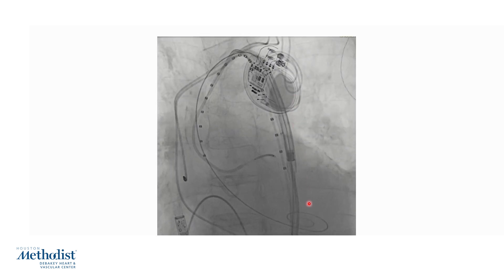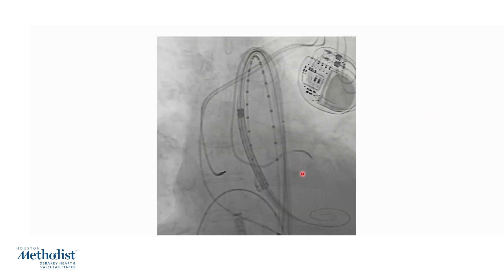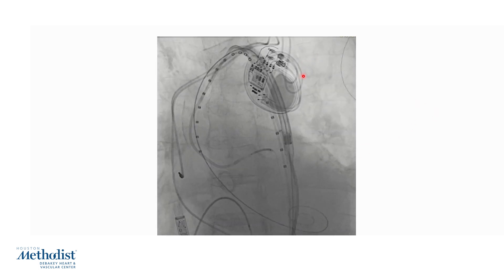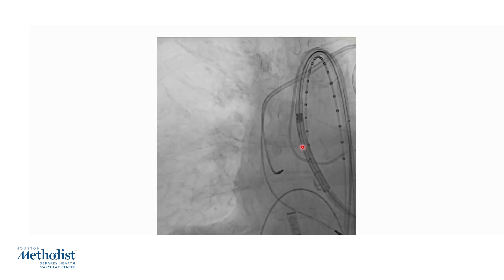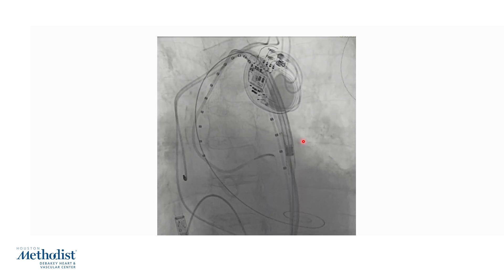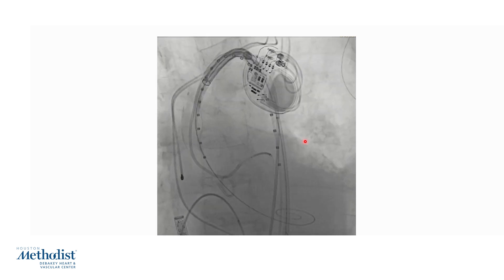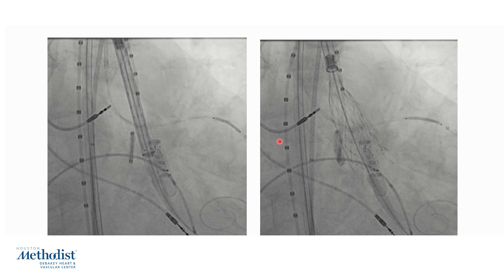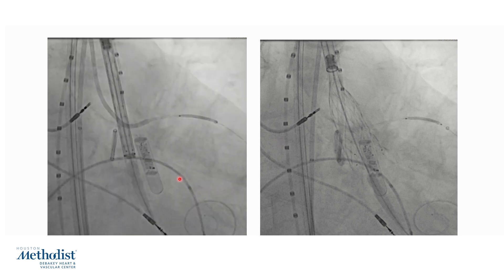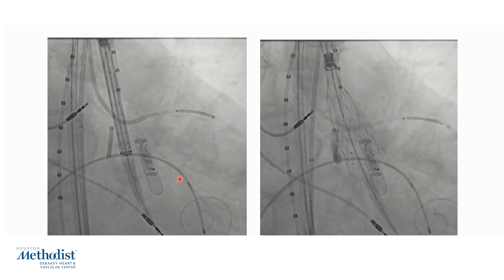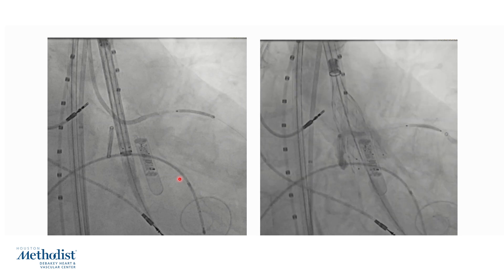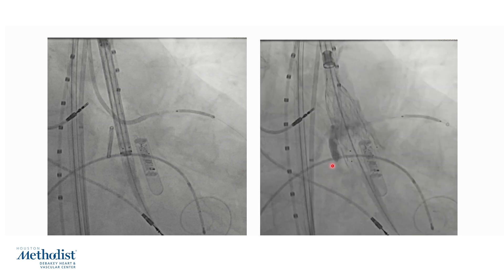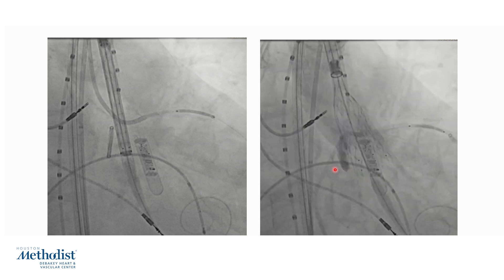Here is the Evolute valve, a self-expandable platform, which is advanced over a Safari wire placed into the left ventricle. We typically put the hat marker on the outer curve and bring it around the arch into the aortic root. By placing the hat marker on the outer curve of the descending thoracic aorta, we can achieve commissural alignment in the vast majority of patients. This image shows the Evolute valve positioned in the aortic annulus in the cusp overlap view, and here is the angiogram at 80% deployment showing good positioning and placement of the Evolute FX valve about three millimeters below the non-coronary cusp nadir.